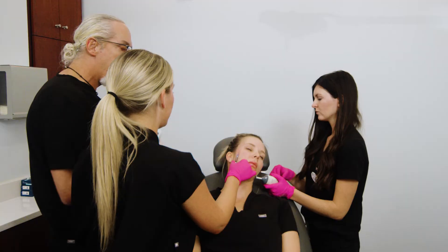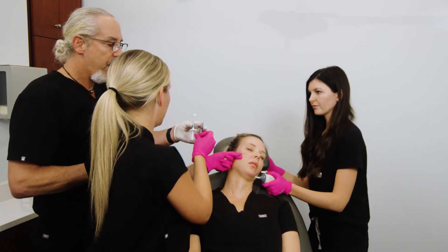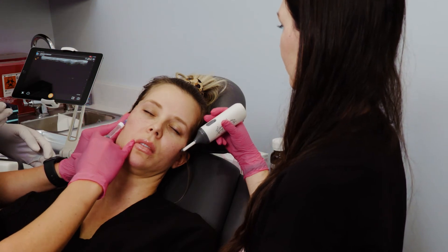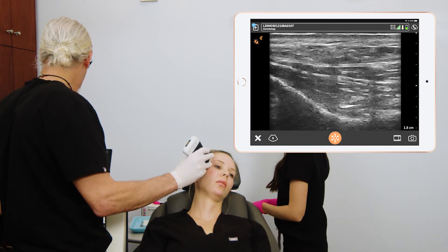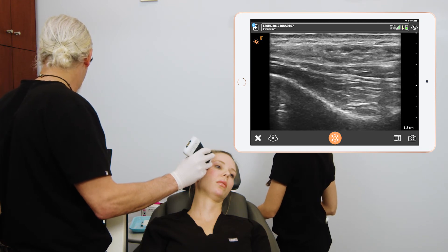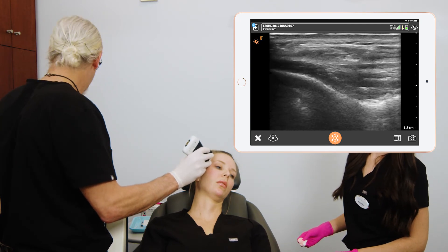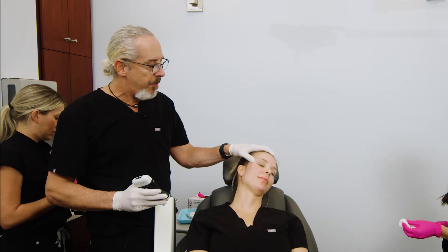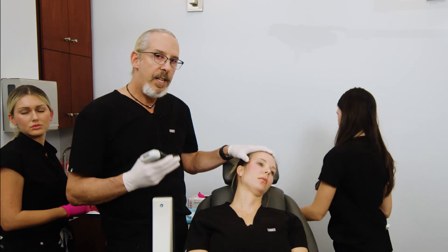Now we're going to take the saline off the cannula and replace it with diluted Restylane. She's going to inject it into that interfacial plane — we'll confirm placement. You can see the filler is within the interfacial plane: here's the deep layer, here's the superficial layer, and the filler is in between the two fascial planes. Then we'll confirm that the artery is intact. That's a nice confirmation using the Clarius L20HD to place filler into the interfacial plane.